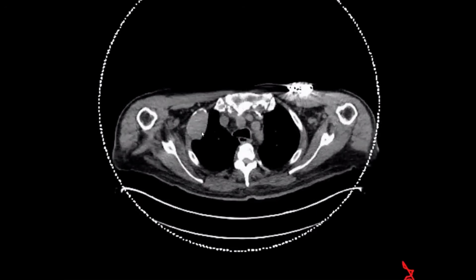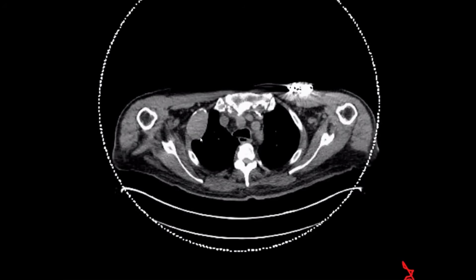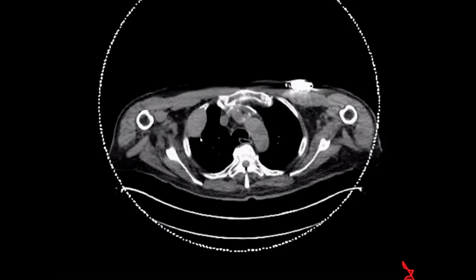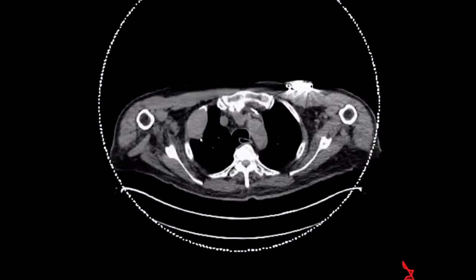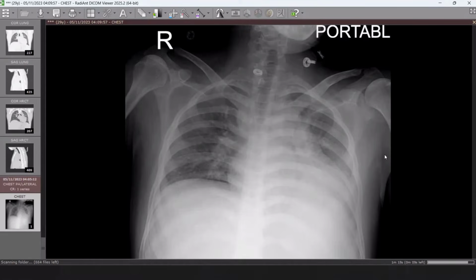All the time we forget this diagnosis. Expansile lytic lesion in an elderly patient: plasmacytoma. Yes, plasmacytoma. Even me, sometimes I forget the possibility of plasmacytoma. It's not common, but you should put it in our differential.